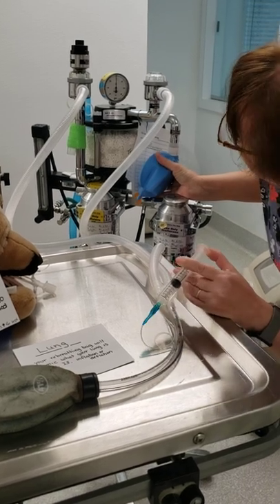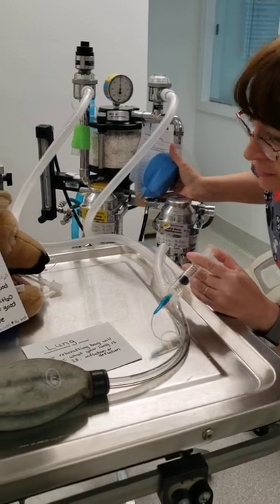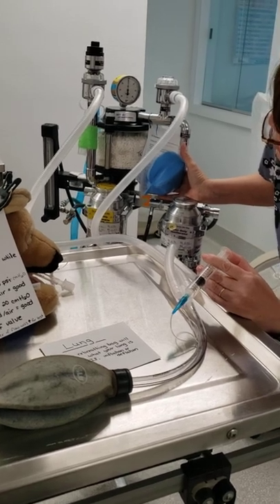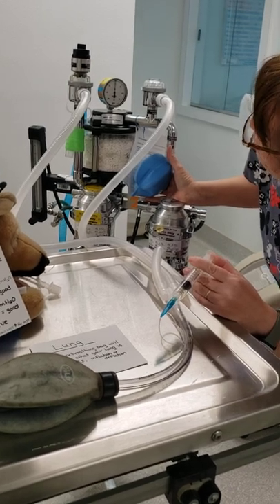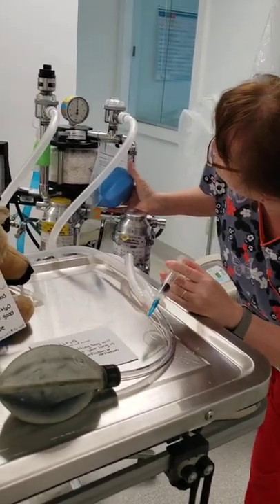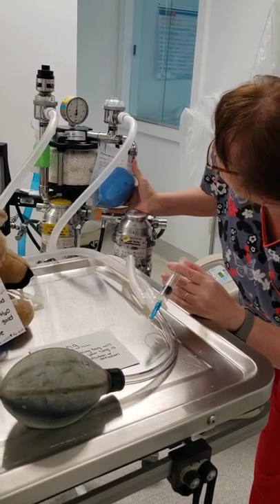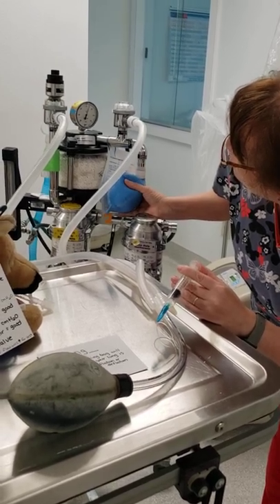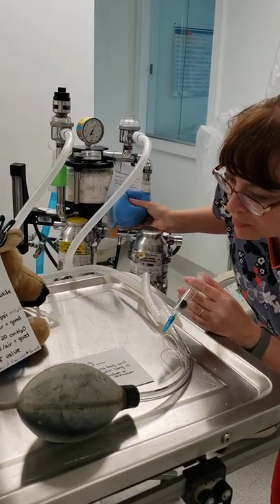I'm going to start filling my cuff with air. You can see my lungs are starting to fill. My bag has oxygen in it. I'm going to give it a second and inflate a little bit more. My manometer is still not moving. As soon as it starts moving, I'm going to start with the squeezing of my bag. Okay, as you can see, my manometer started moving, so I'm going to give it a squeeze. And I can hear air coming out of my bag.